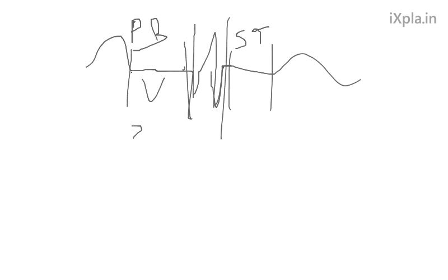is causing the angle to move in a different direction, either going to the right axis of the heart, which is going kind of into, I've got to do a little orientation, into the right ventricle. Or maybe the axis is going into the right atrium, going completely backwards for some reason. That would not be good. There's nothing that can justify, in a healthy individual, the angle going backwards. Or maybe for some reason the electrical angle is going into the left atrium. Again, that's not really normal.